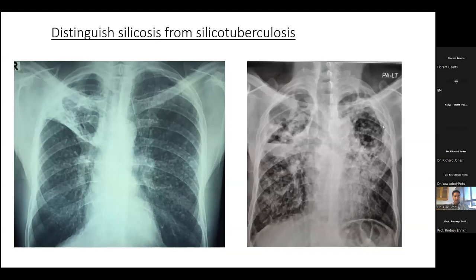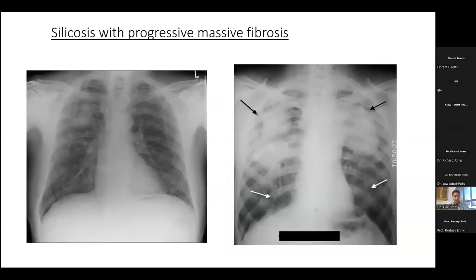The other X-ray is extremely difficult. We can see lots of nodules, large nodules of different size. There seems to be an air fluid level, possibly the filling of a cavity. Maybe there's a fungal infection in there. There's pleural thickening. So this is a problem facing readers and it's a problem facing CAD. And finally, of the pictures, next slide, please.